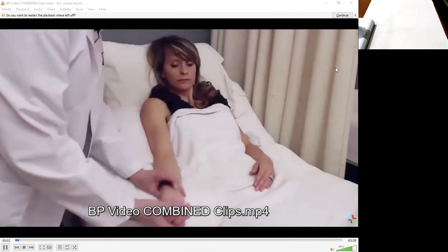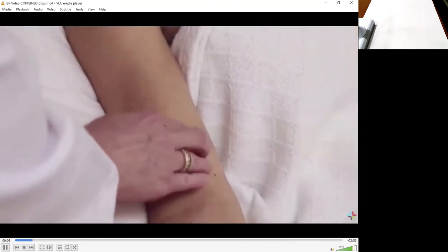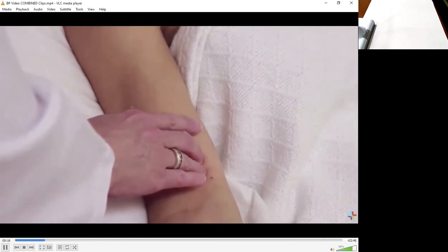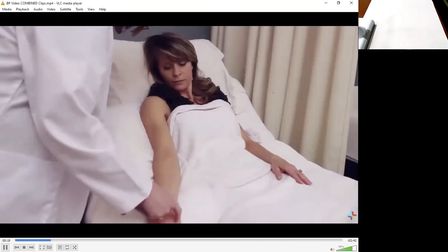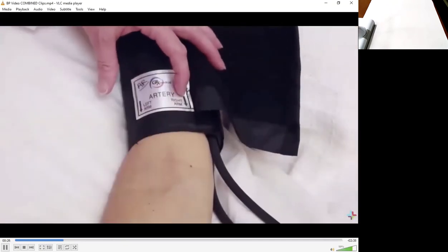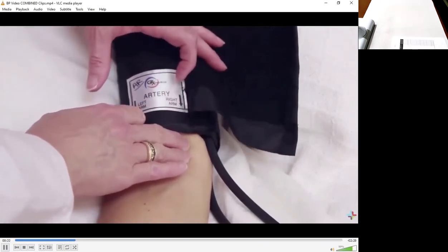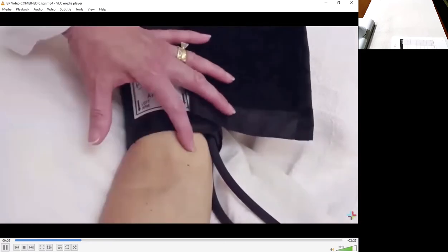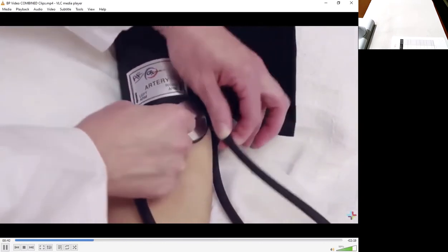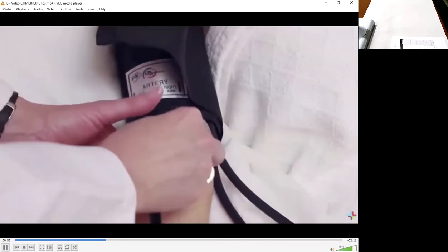To locate the brachial artery, the easiest way is just to draw a line up the pinky above the bend of the elbow. And that's where you'll position your cuff arrow. And that's also where you'll place your diaphragm and your stethoscope. Again, you just draw an arrow up the pinky, and that's where you're going to find it. Up on the arm, this is your right arm. Draw a line up the pinky, and that's where the arrow will be placed. This is also where the diaphragm of the stethoscope will go, right here. You definitely don't want to put the diaphragm underneath the cuff. Try to get as much away from the cuff as possible.